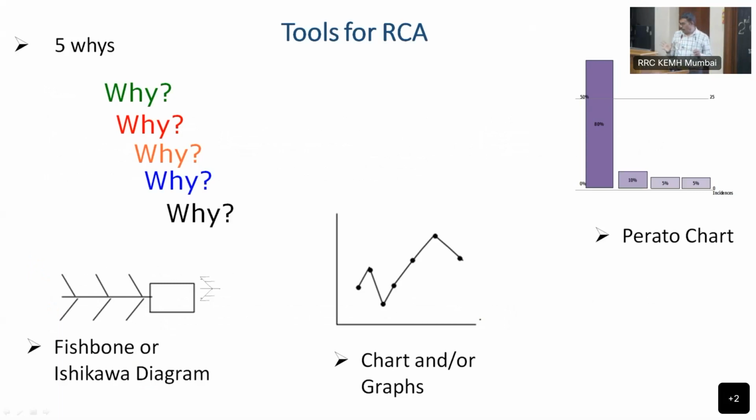There are 4 methods of doing RCA. Any of them can be employed. Telling you, 4 methods. I'm really inclined to use this. Okay. Every method has its merits and demerits. The enjoyable one is 5 whys. You can enjoy it, you can prepare it. But for this you need a little bit of brain, brainstorming, a little bit of thinking, okay?